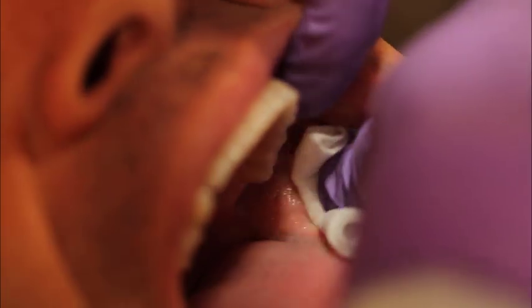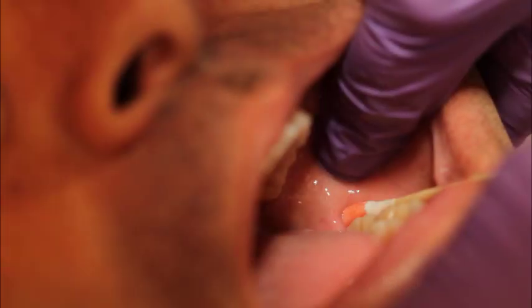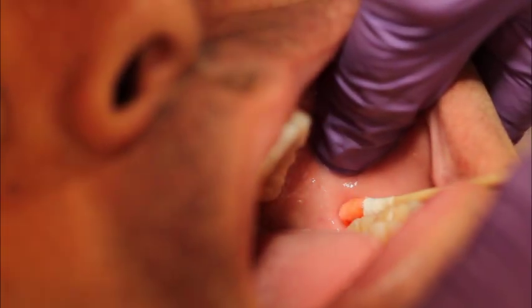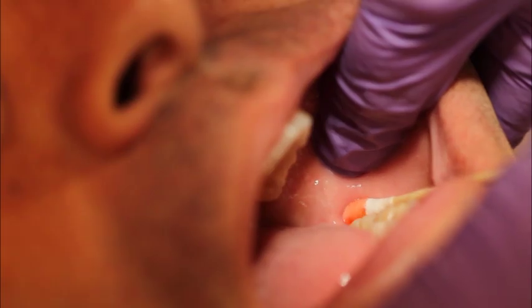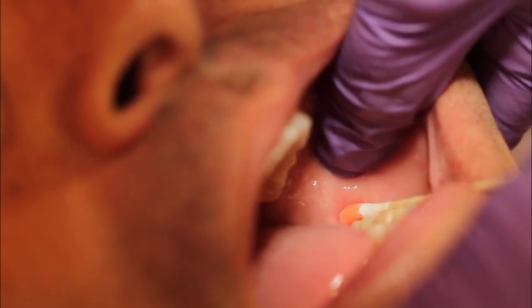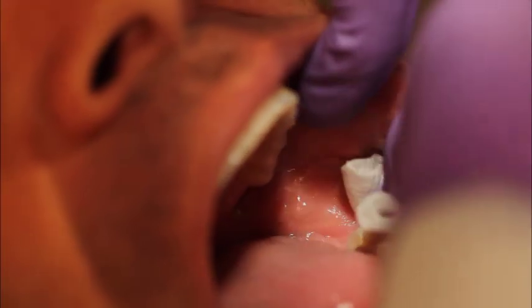Dry the penetration site and prepare the alveolar mucosal tissue with topical anesthetic in the vestibule, distal and buccal to the most distal molar in the quadrant at the height of the occlusal plane. A previous inferior alveolar block will not anesthetize the buccal soft tissue. Dry the tissue to remove any excess topical anesthetic.